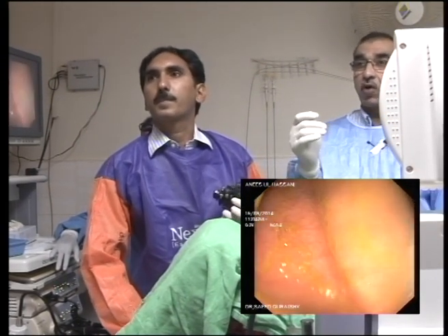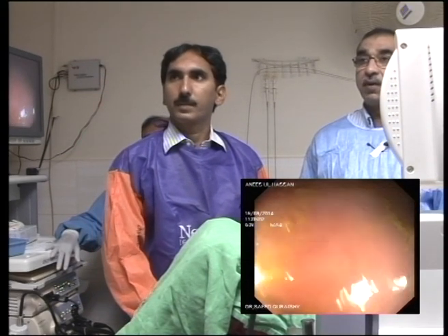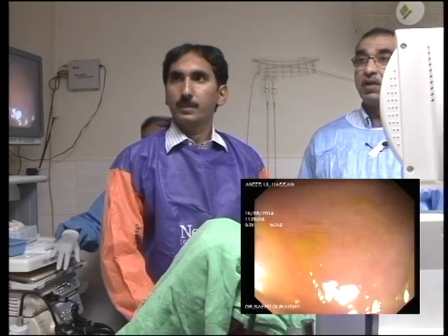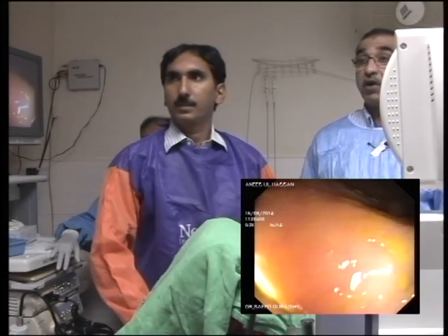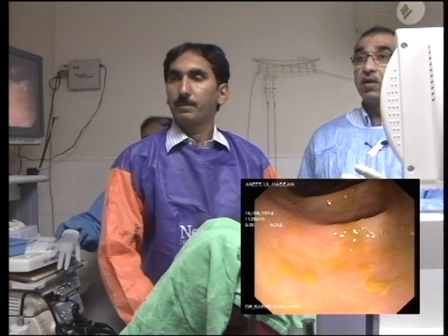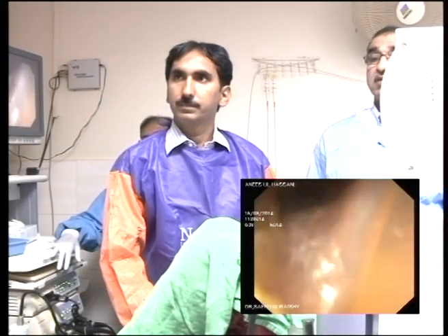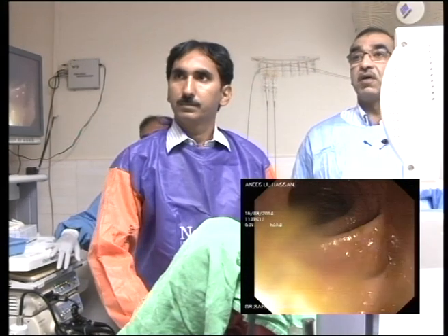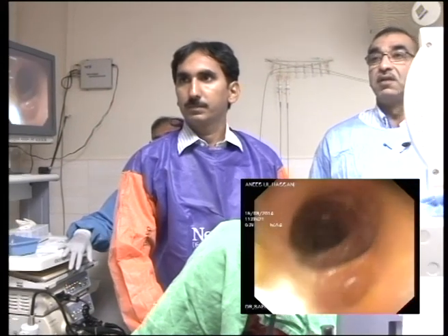Now get it clockwise and up. Point up, up, up. Point your tip up, big wheel, up, up. Keep pointing up. Hold your scope there. Now advance. Advance. Okay, that's fine. Wash. Very good. That's good.